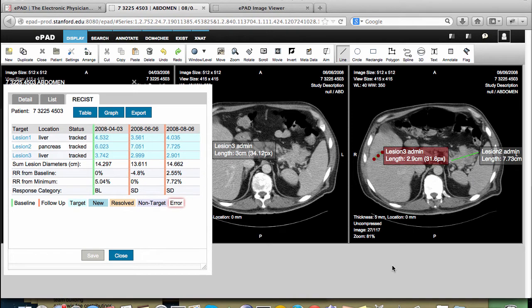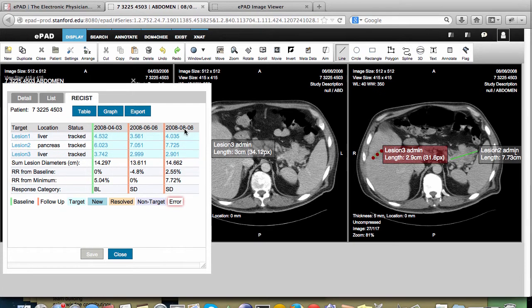Now let's look at the lesion summary table again. We can see that we've measured lesion 3 and our table is complete for the current exam. By the way, we have defined a standard way to capture the annotations so you can share them with other researchers and clinicians. It's called AIM, Annotation and Image Markup. Other image viewers and image applications can already read and write AIM annotations.